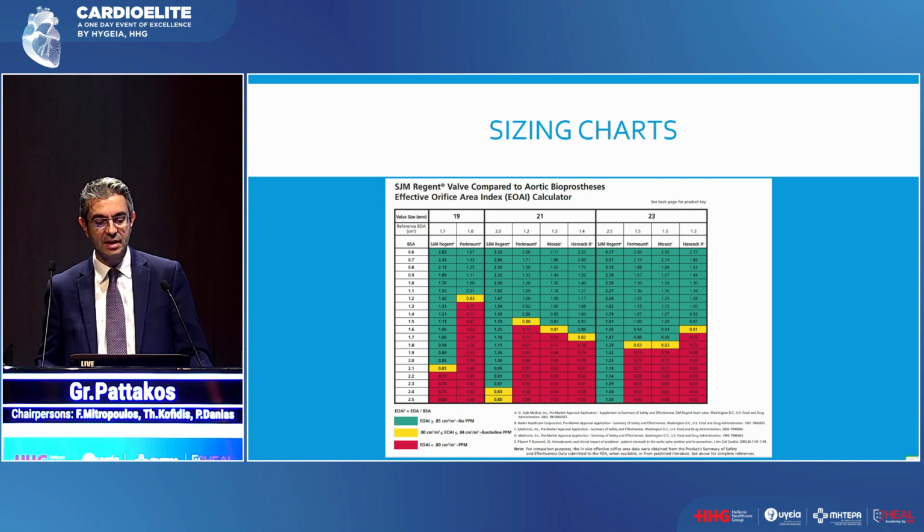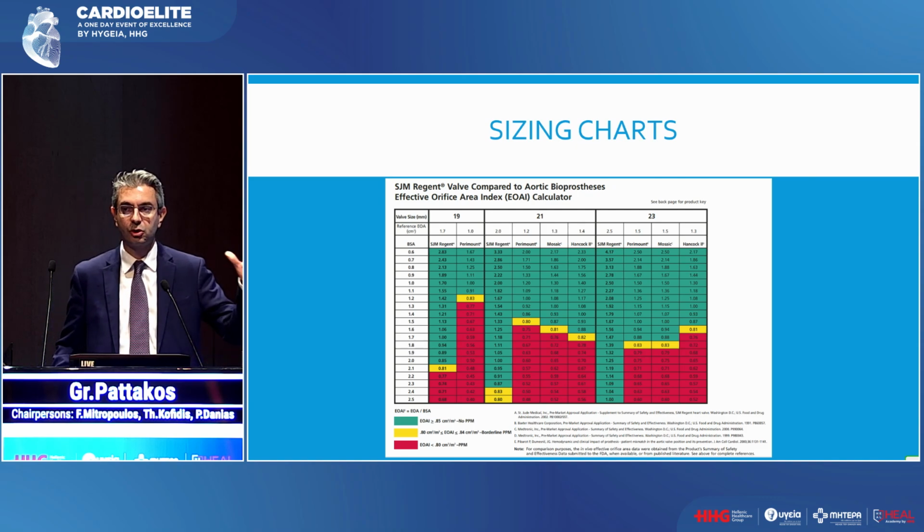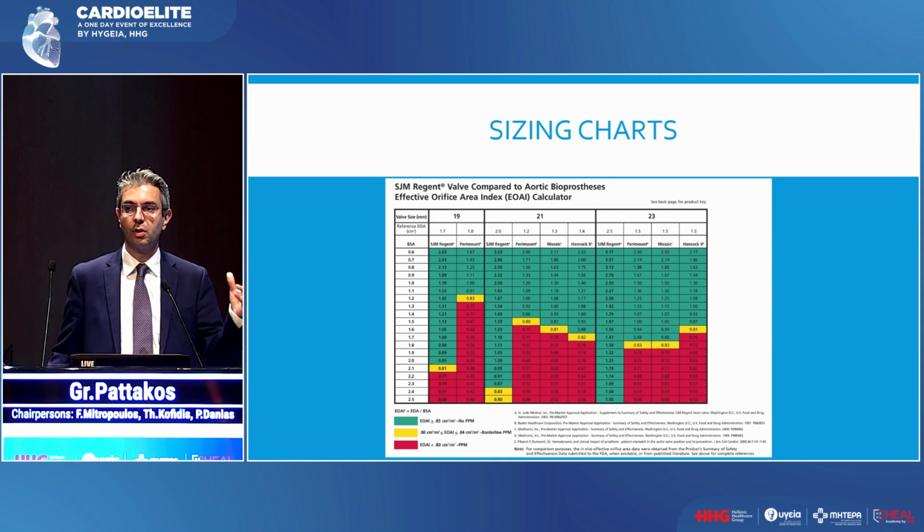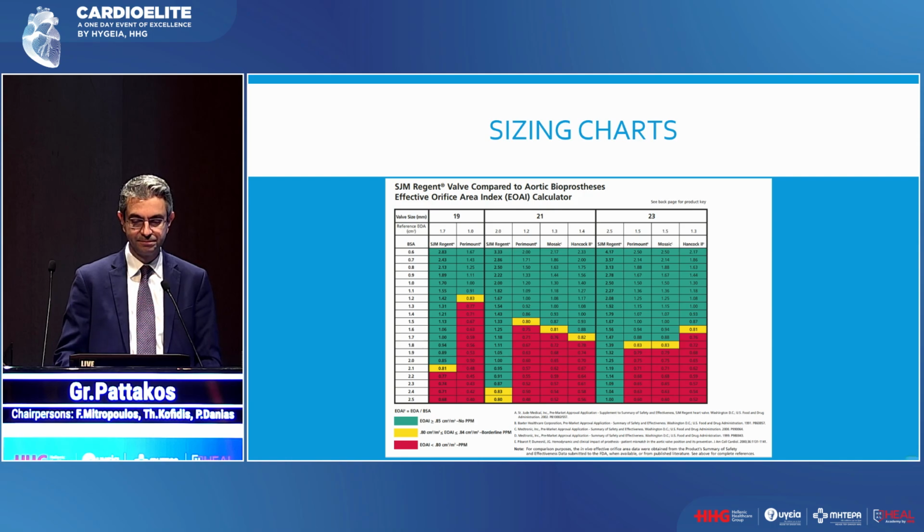That's why we have these sizing charts, and so various companies come up with these charts, and they tell you that, Dr. Pattakos, your patient has a BSA of, let's say, 2, and so for this patient, you need this size valve to be in the green zone with no patient prosthesis mismatch. With this size, you go into the yellow. With this size, you go into the red.